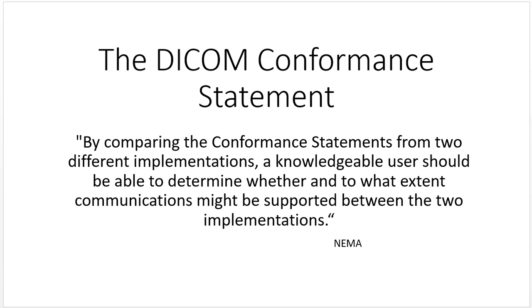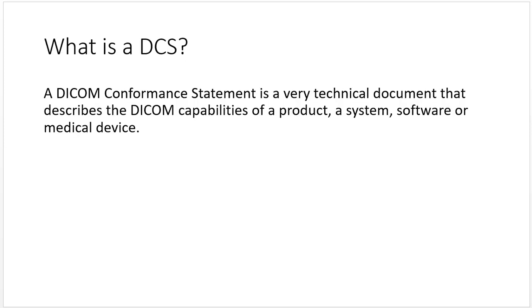That is a fancy way of saying if you have a DICOM conformance statement from a CT scanner and a DICOM conformance statement from a PACS, you ought to be able to put those two documents side by side, compare them, and figure out how those two devices work together. So, the DICOM conformance statement will tell you how an AE will communicate with other AEs on your DICOM network.